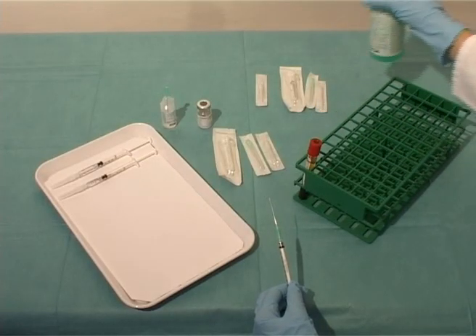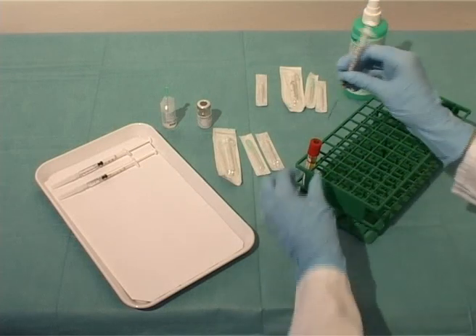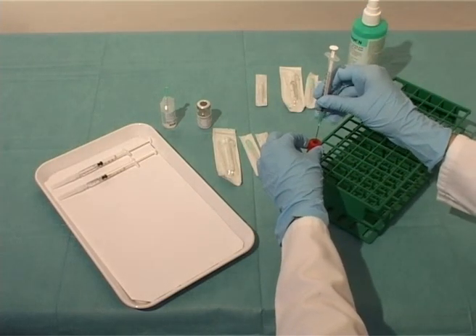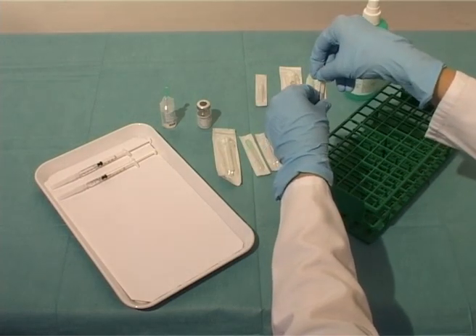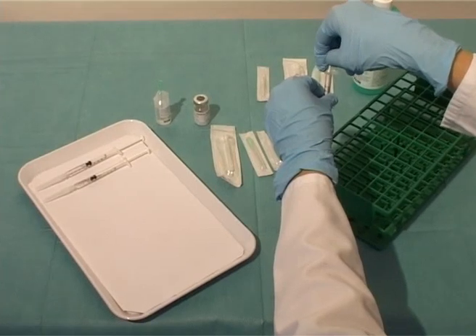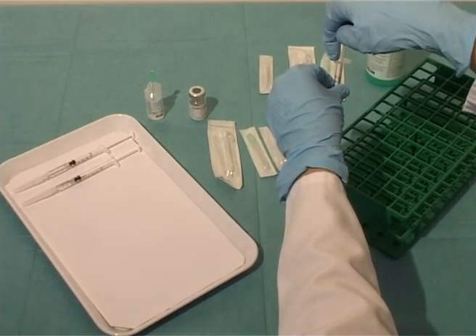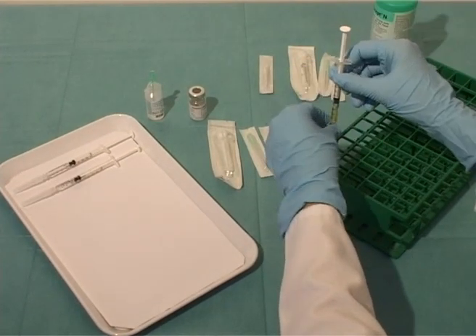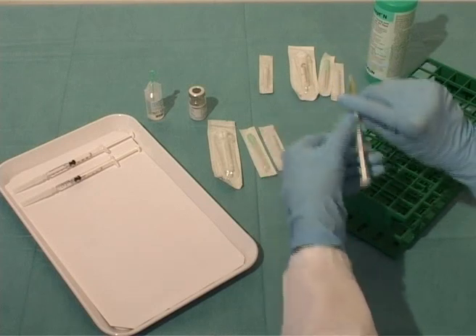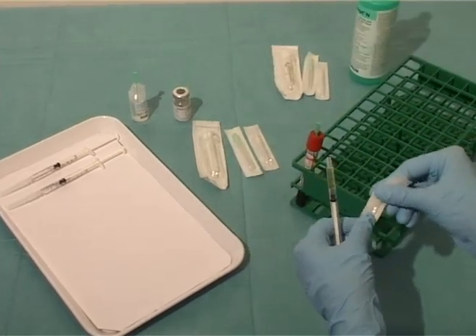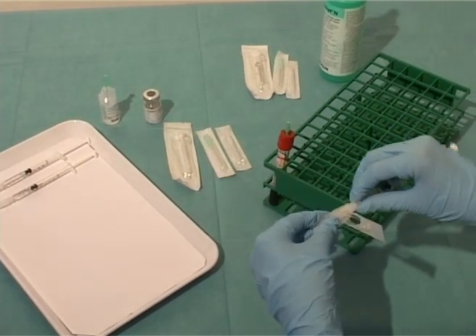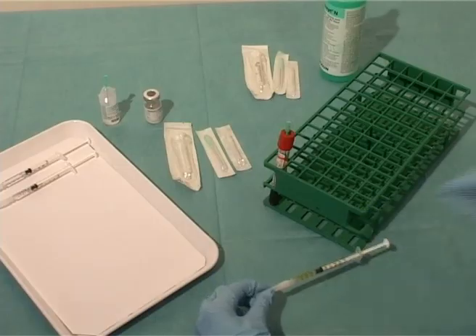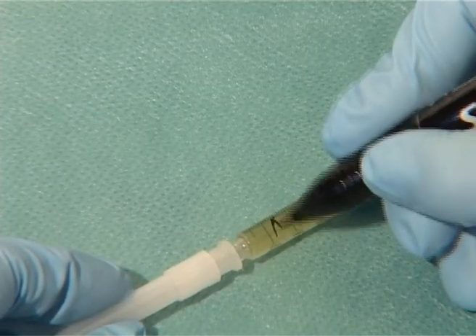Before the serum is drawn, the identity of the blood sample must be established without doubt. The slightest uncertainty means the sample must be discarded. The drawing of the patient's serum takes place through a 0.8 mm needle into a 1 mL syringe. The syringe is marked with a permanent marker and put aside.